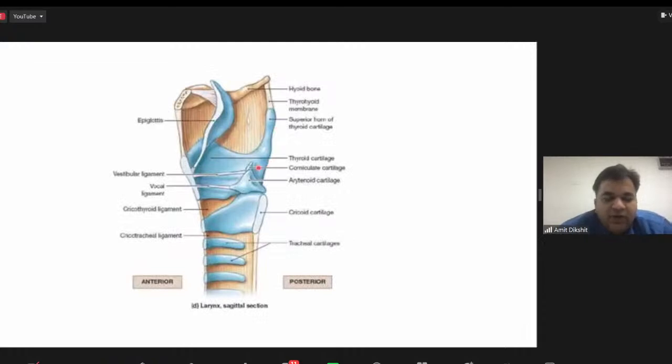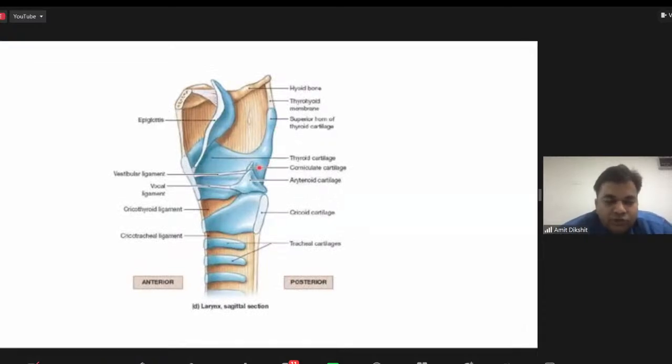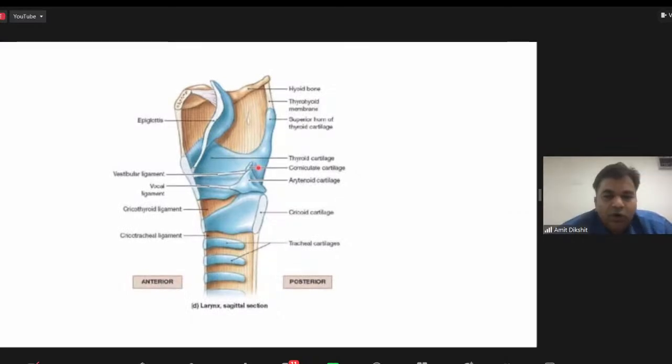Now, when we talk about difficult airway, we are talking about the presence of soft tissues on the anterior neck surface. So you will see calculations like skin to epiglottis, skin to vocal cord, skin to hyoid bone, skin to isthmus. All these are basically trying to gauge how much soft tissue is on the anterior neck surface. It can be seen in neutral position as well as in hyperextended neck position. So is there any displacement with positioning of the patient? These are the parameters we'll be assessing.